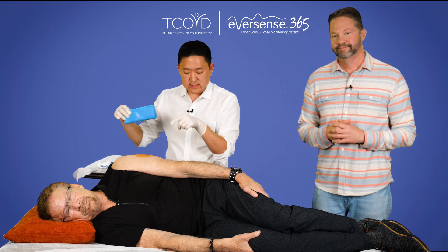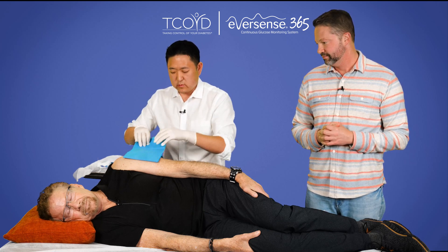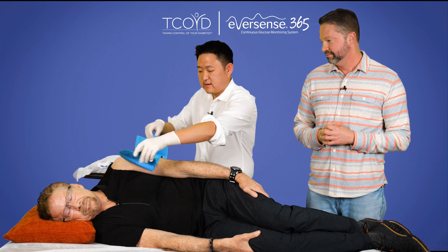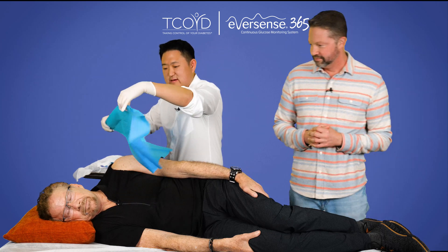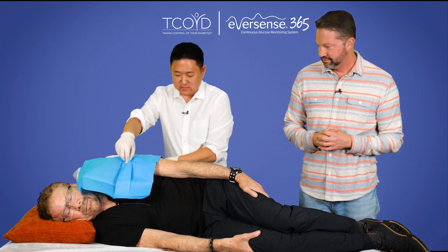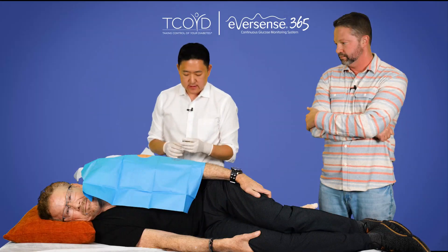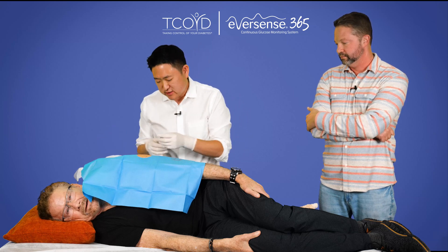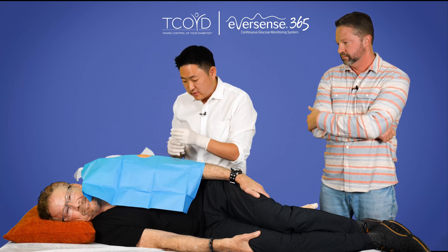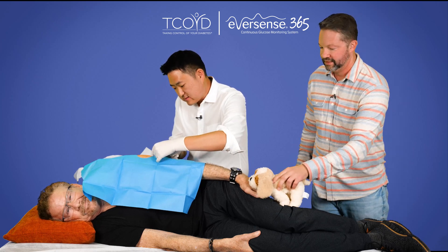Now that the area is clean from the betadine, we're going to put on the sterile drape. There's a little window for where the procedure site will be. And this part is where I usually reassure the patient that even though we're going to cover part of the face, it's going to be real short and will be done very shortly. All right, so we've drawn up some lidocaine, which is going to numb the area.